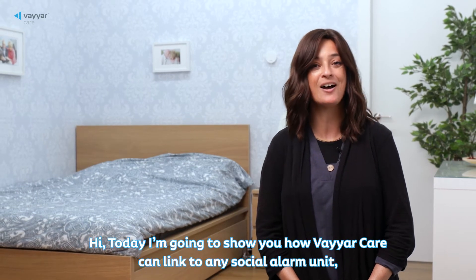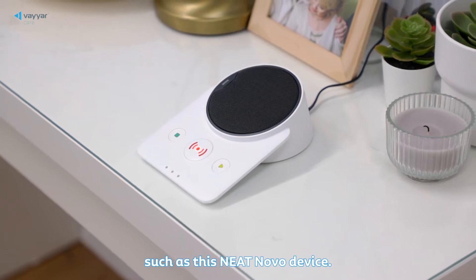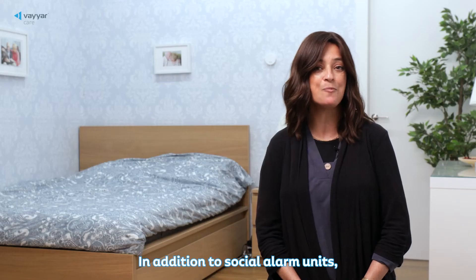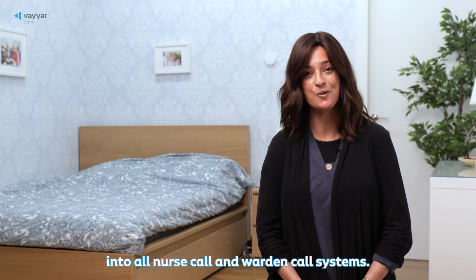Hi, today I'm going to show you how ViarCare can link to any social alarm unit, such as this NeatNovo device. In addition to social alarm units, ViarCare can support dry contact integration into all nurse call and warden call systems.